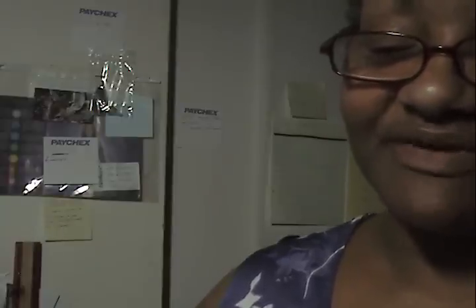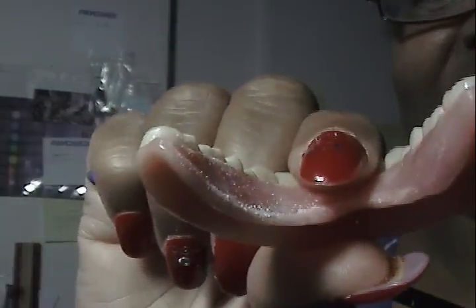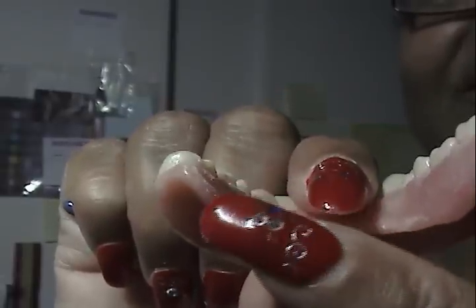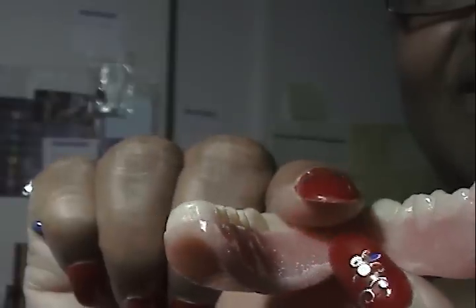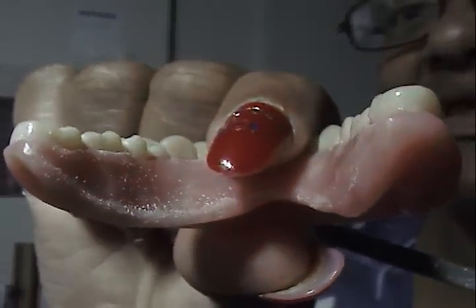That's where really the Dremel comes in handy, because even this U part right here, at the bottom of the U part, is blunt. And then, I don't know if you could see it. Along here. See, this is where it's really blunt, right along here. All halfway around. And then this side isn't. You can't really tell. Okay, now you can.